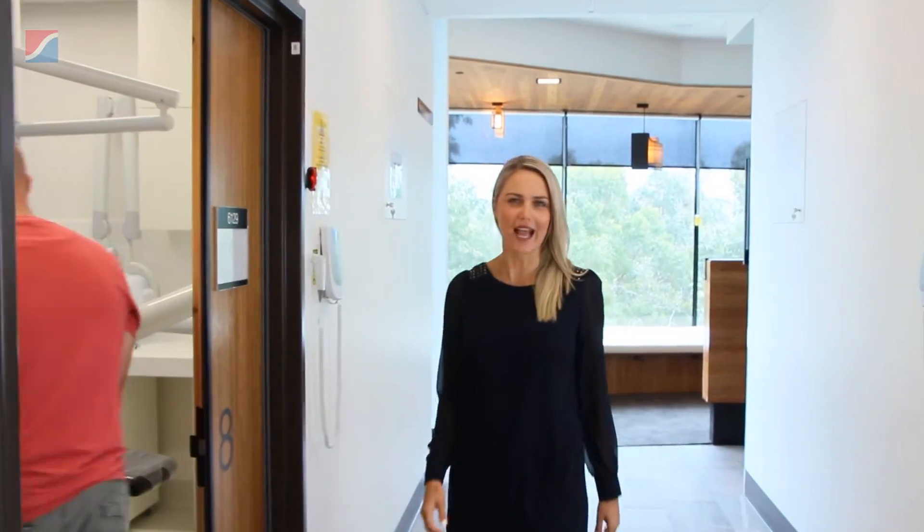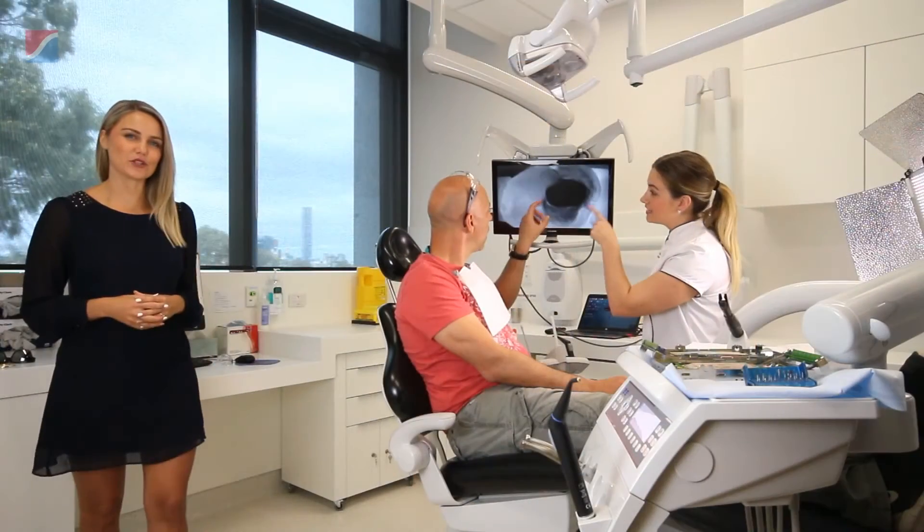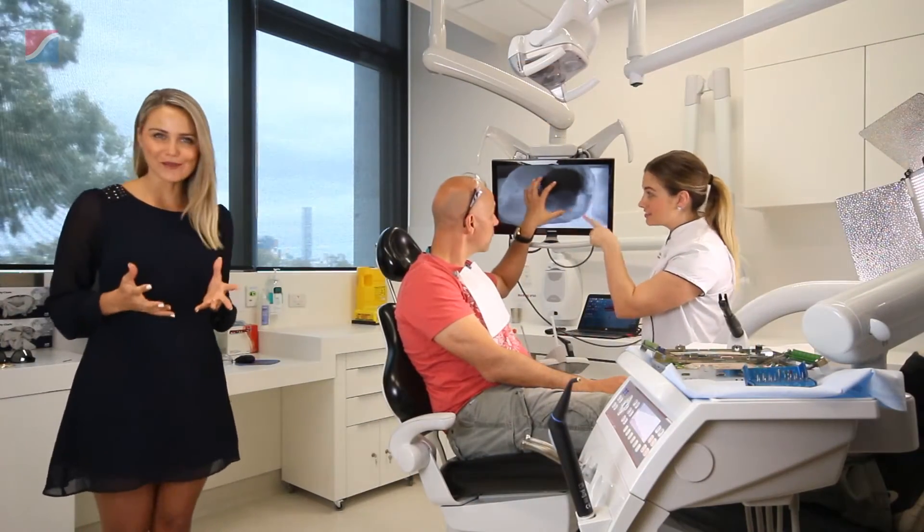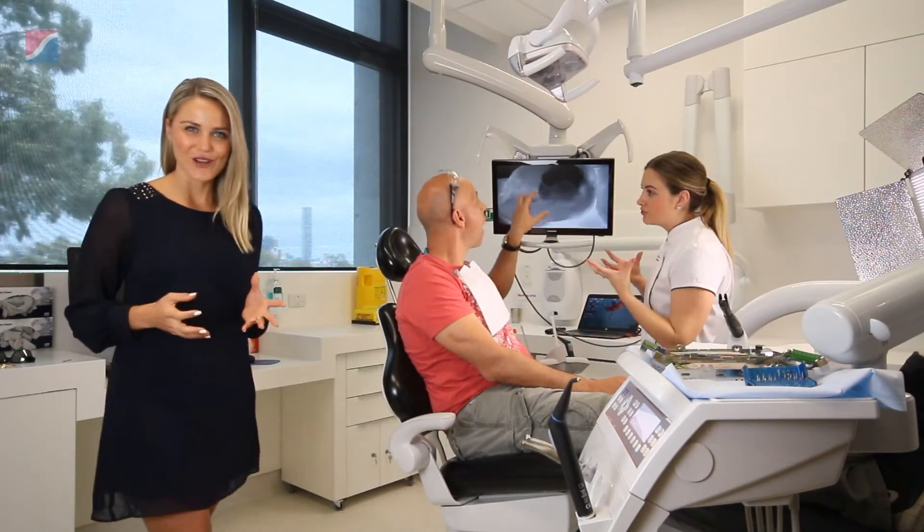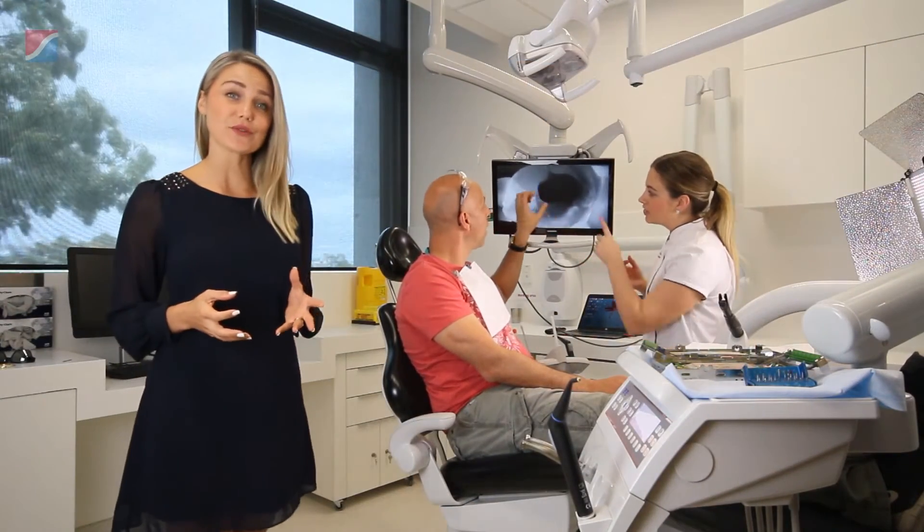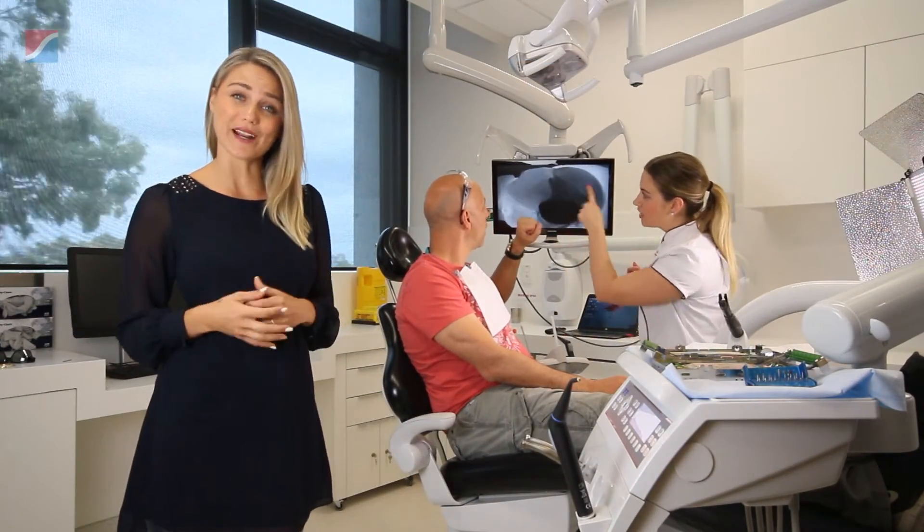Do you want to bridge the gap between patient understanding and diagnosis? Do you sometimes wish you had a second pair of eyes without having to resort to an x-ray?